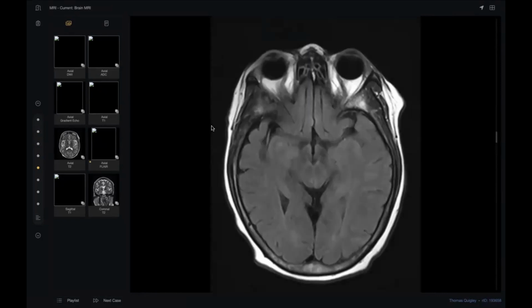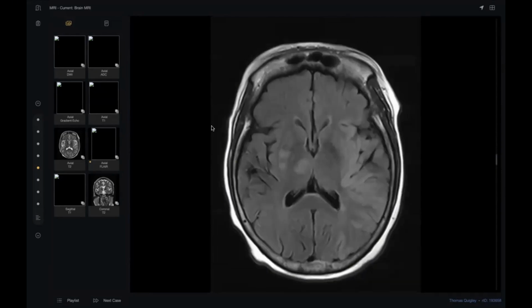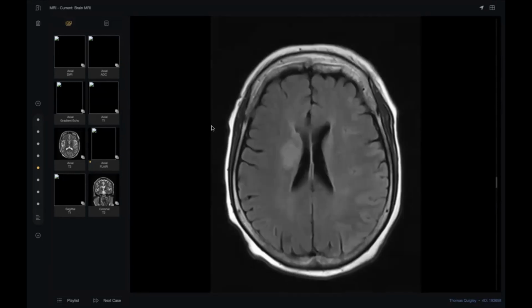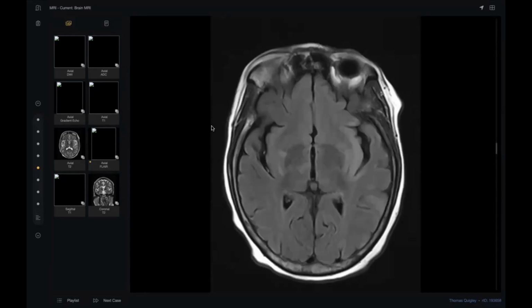Tell me, Dr. Nagam and all my colleagues, my advice for you in a very long case like this, and I think this new Viva system must include some cases like this, multimodality: try to describe in very short bullets and tell the differential. Tell what happened here. What is this? The patient has atrial thrombus, and then I give you this brain. What should you tell me?